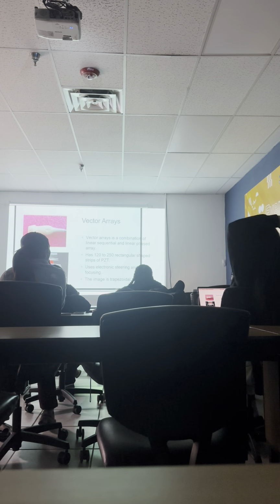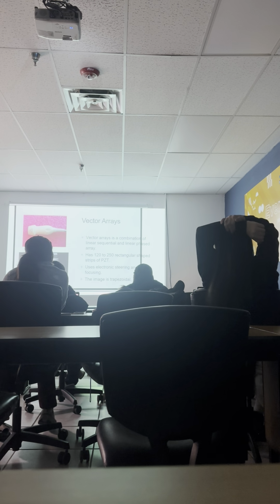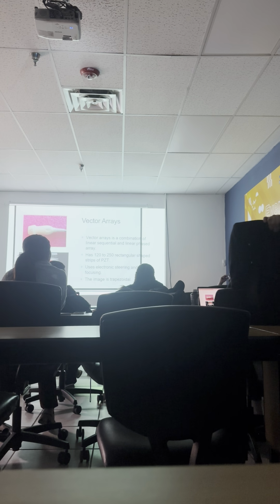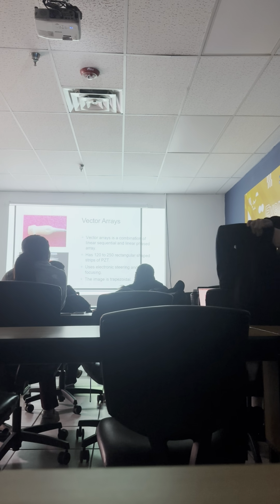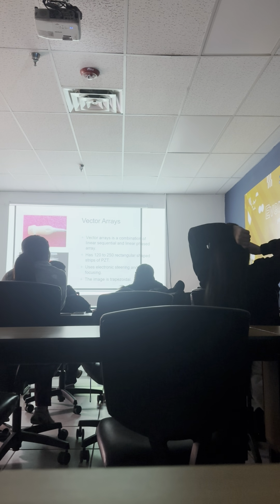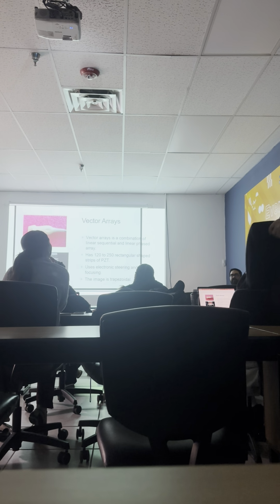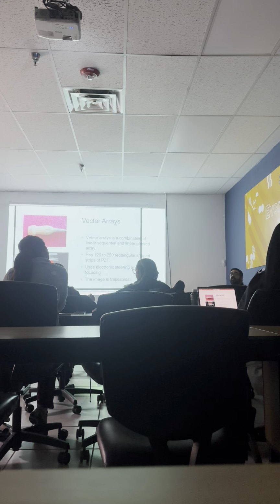So delicate. Not for this, but for cranial exams, do you have to shave their head? No, it's going to be transtemporal, transorbital, or occipital. So we would never scan right on top of the head? No, except for neonates, because they still have that open area. Some have a soft spot on their head, and you can tell. You can see it pulsing, you can see the brain.